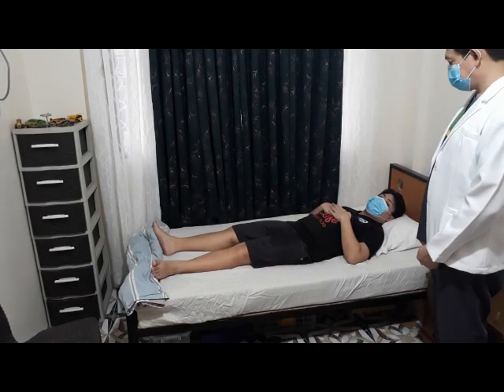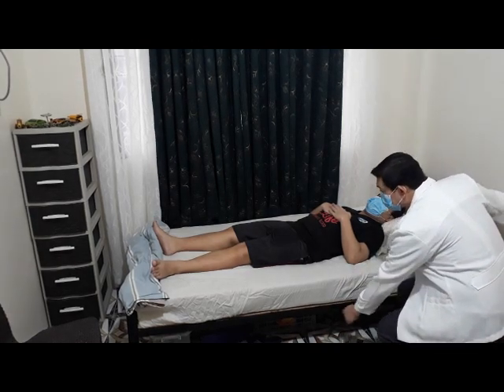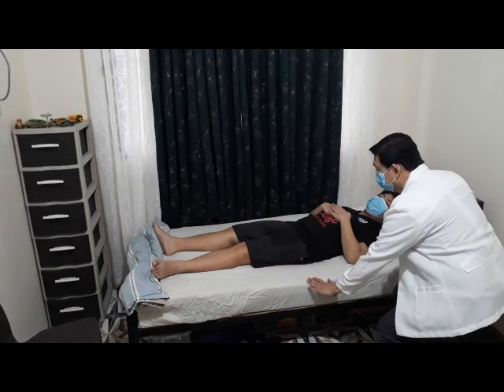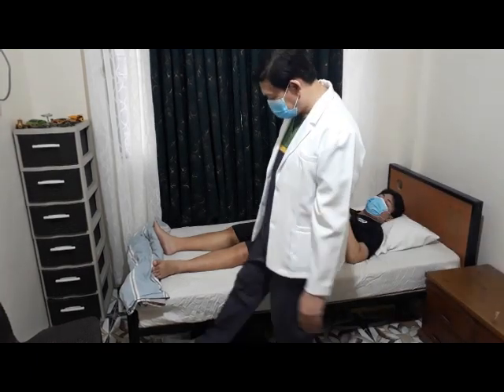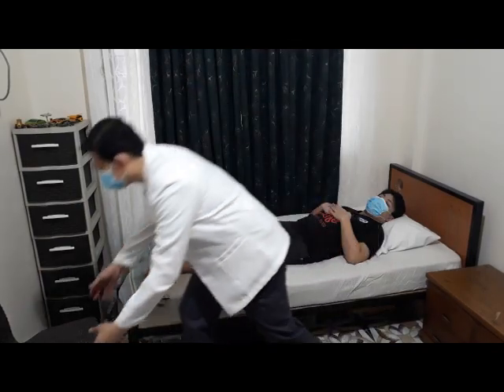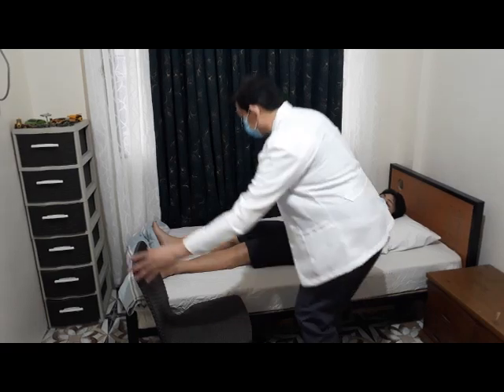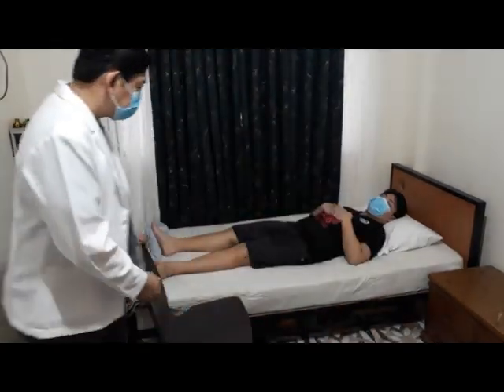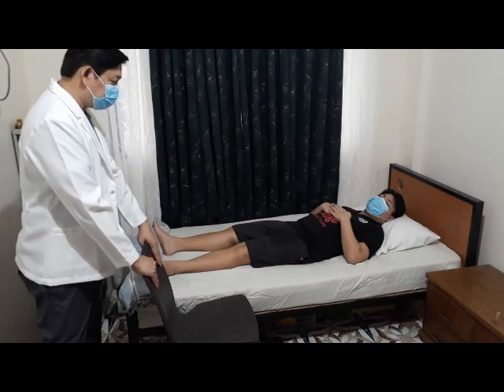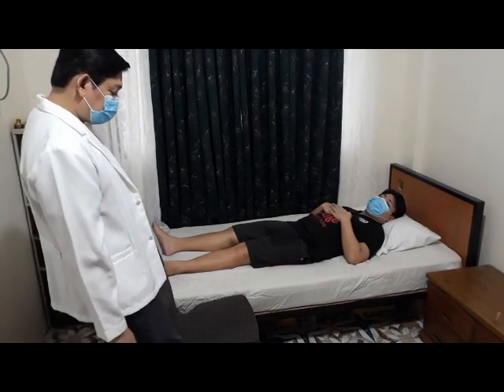Position equipment appropriately. Lower bed to its lowest position. Lock wheels of the bed. Place wheelchair parallel to the bed, as close to the bed as possible. Put the chair on the side of the bed that allows the client to move toward their stronger side. Lock wheels of the chair or the wheelchair and raise foot plate.